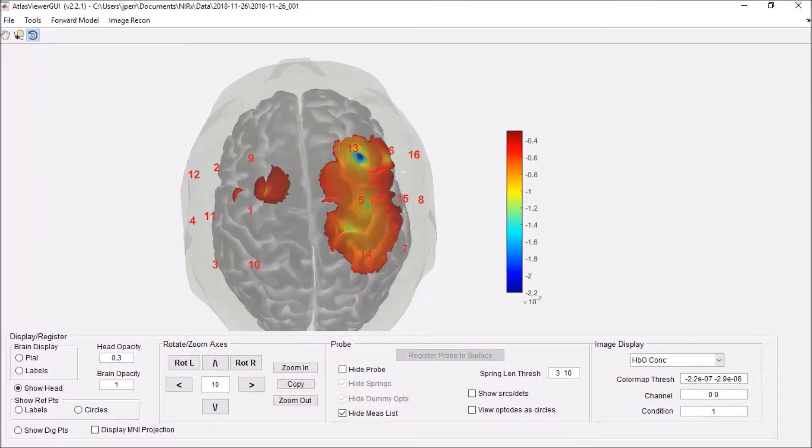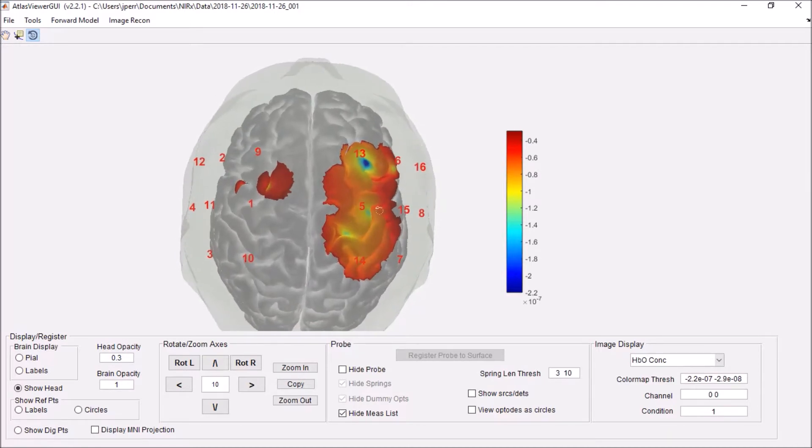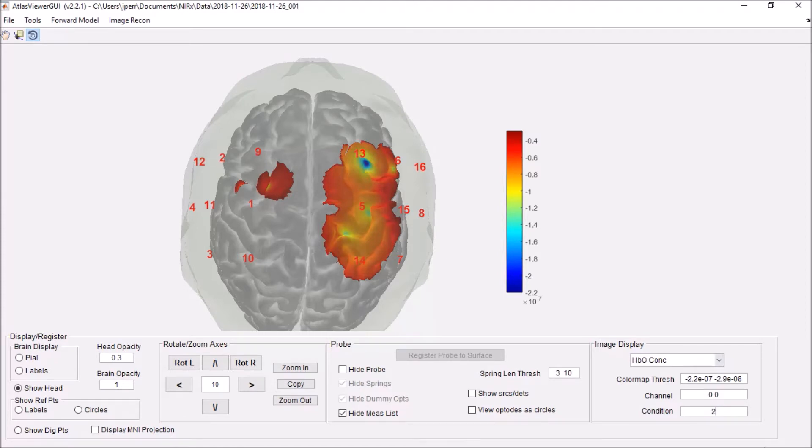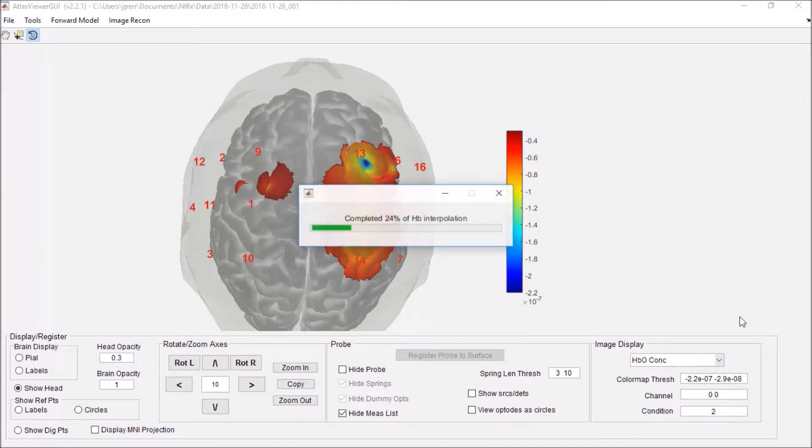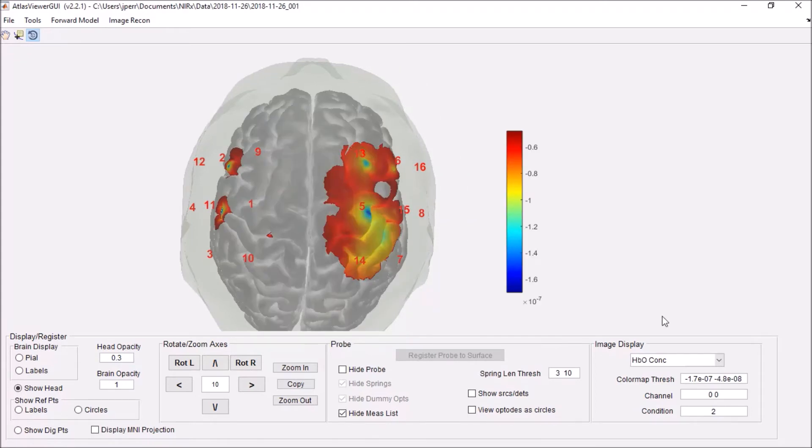Once it's done, there it is. So you can actually see the concentration data. You'll see I'm looking at HBO concentration here for condition 1. I can also select condition 2. When I click off, it will rerun it. And there's condition 2. Slightly different on the left side there.